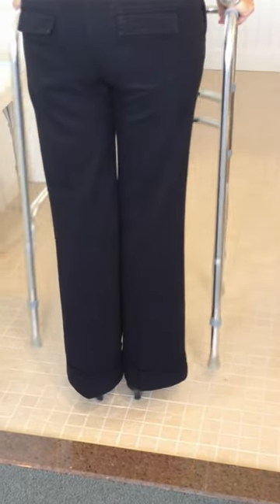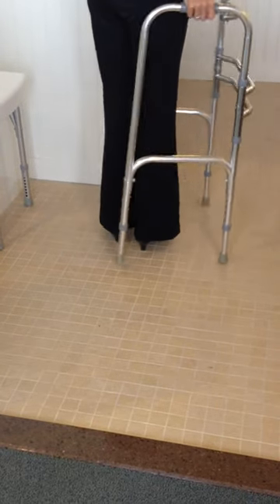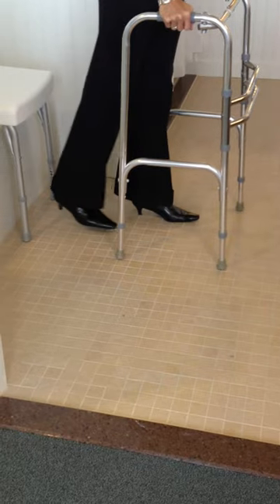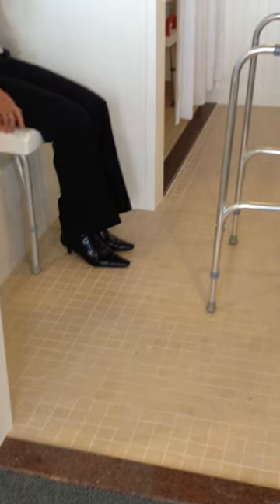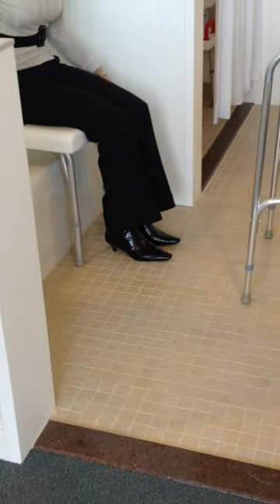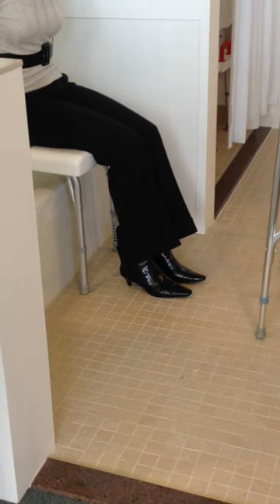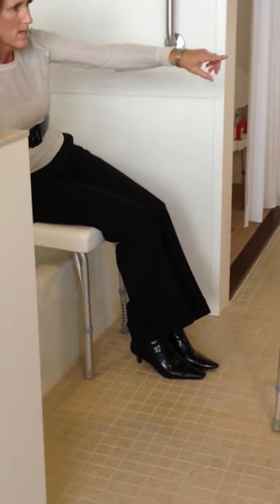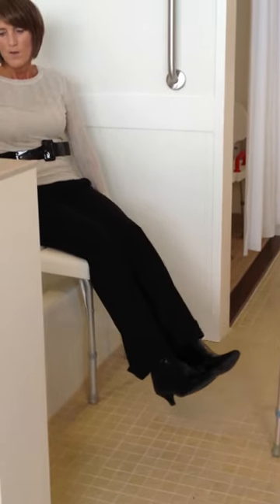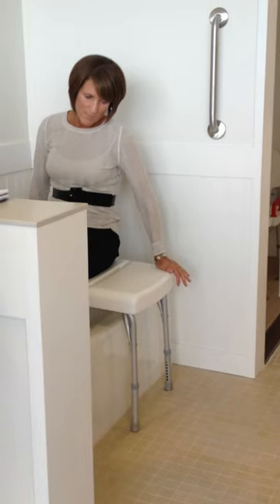You're going to have your patient walk with their affected leg first, up to the chair. Then we're going to go backward and leave with the other leg. You're going to have them sit this way on the tub — you might need a scooch back. Hopefully they'd be able to do this by themselves. I think this tub is smaller than a regular tub, so I'll have to measure it. Probably they would have good trunk stability, so you might not need a seat with a back. This one has a back that goes on — I took it off because once I get over this way, I kind of lean back to get my legs over and in and out.